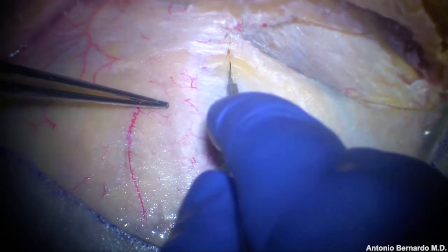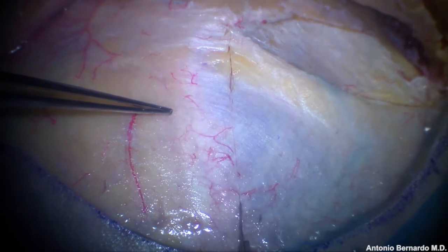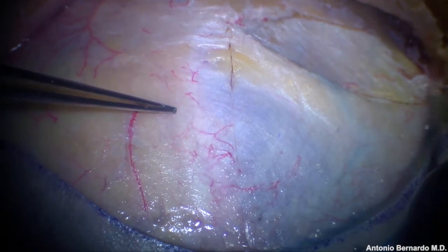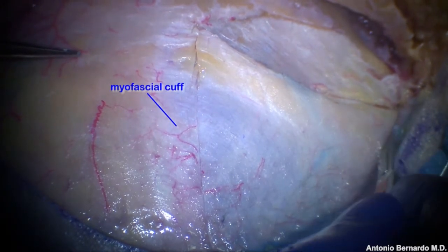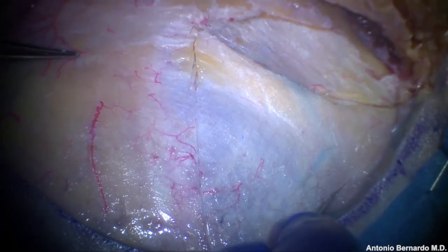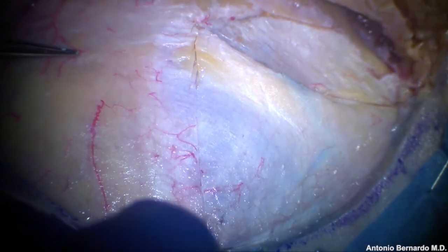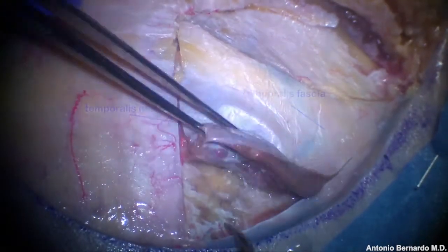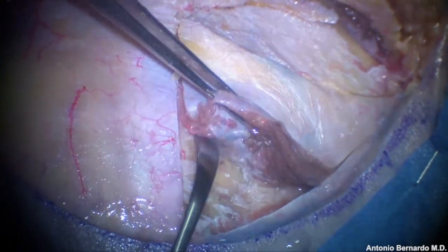The temporalis fascia and muscle are incised sharply along the margin of the superior temporal line, leaving just a narrow myofascial cuff attached to the bone. The temporalis muscle is elevated and reflected inferiorly.